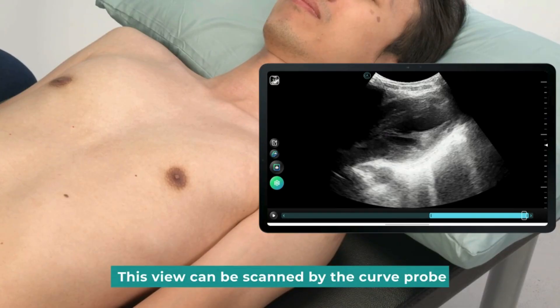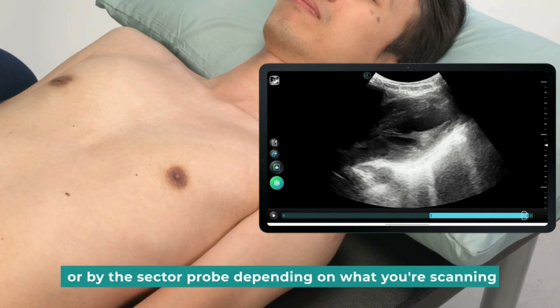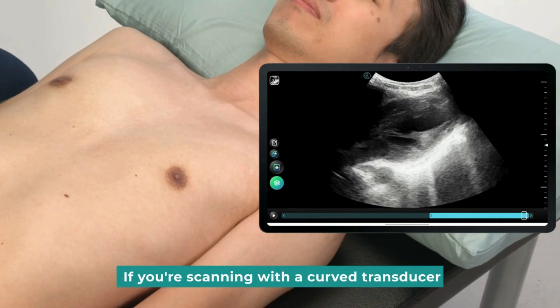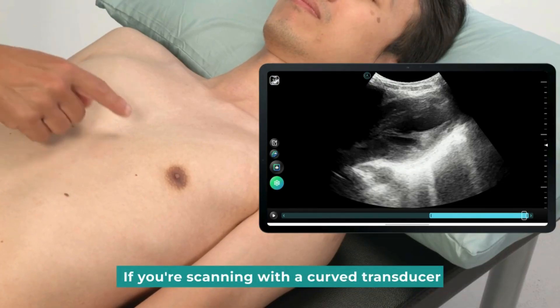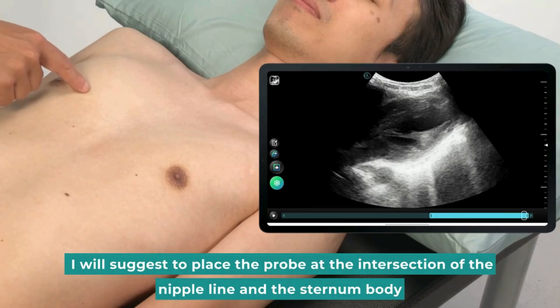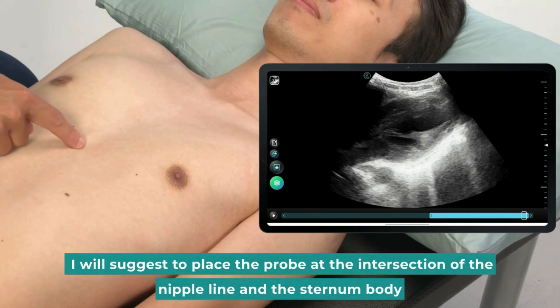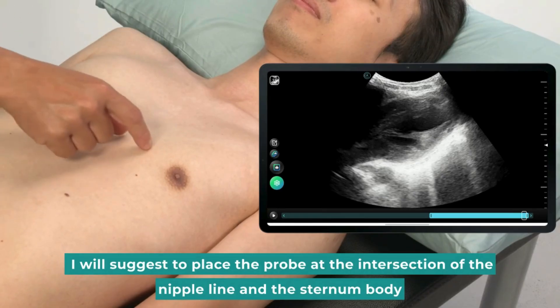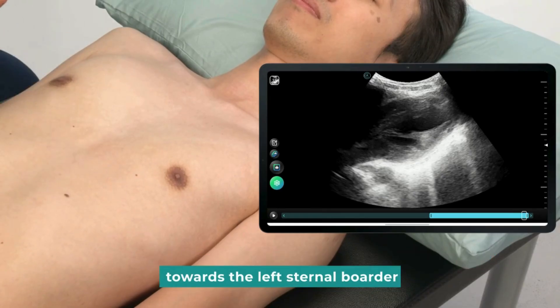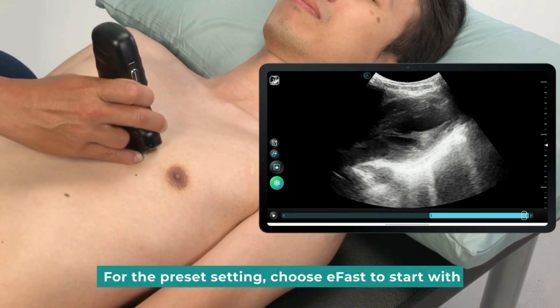This view can be scanned by the curved probe or by the sector probe, depending on what you're scanning. If you're scanning with a curved transducer, I will suggest placing the probe at the intersection of the nipple line and the sternum body, towards the left sternal border. For the preset setting, choose EFAST to start with.